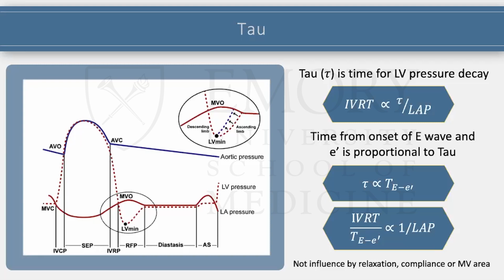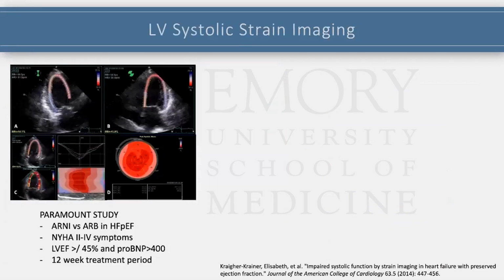You have to measure this like 4 different times during the study, and their heart rate kind of has to be roughly the same in all of them. So you have to have a really experienced echocardiographer and then a patient whose heart wants to beat at the same rate for the entire study. Just not that easy to do. And because of that, not going to be so reliable.